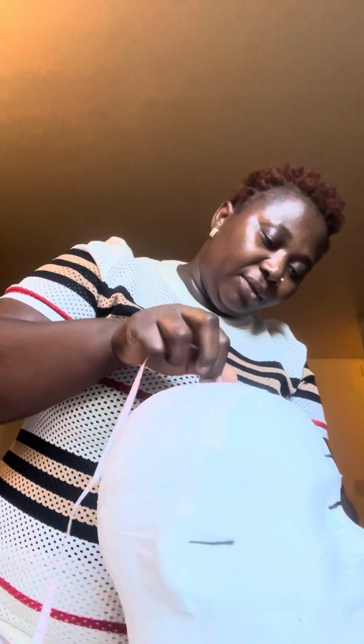So I'm going to measure from the preauricular left to the preauricular right through CZ. Okay, 33. So 10% will be 3.3, which is your T3.